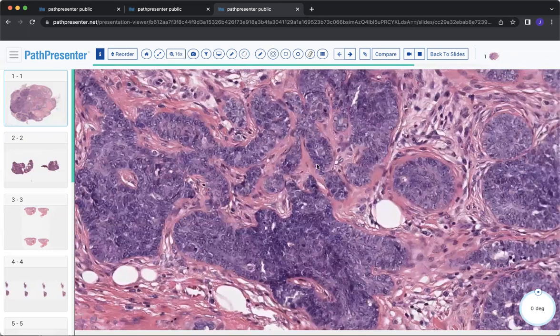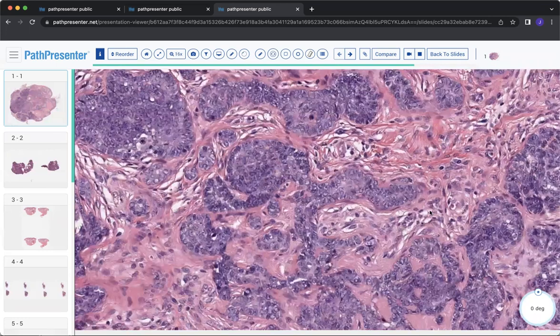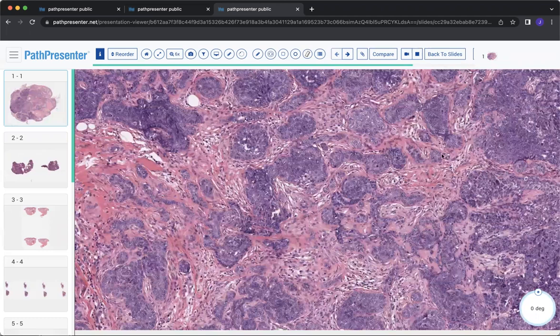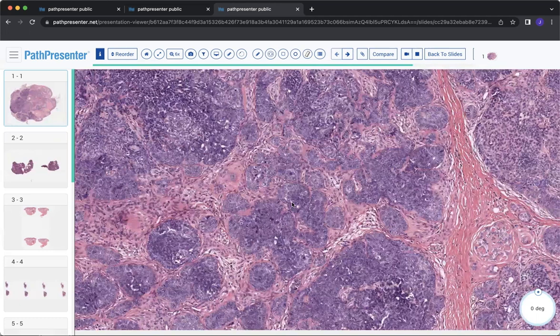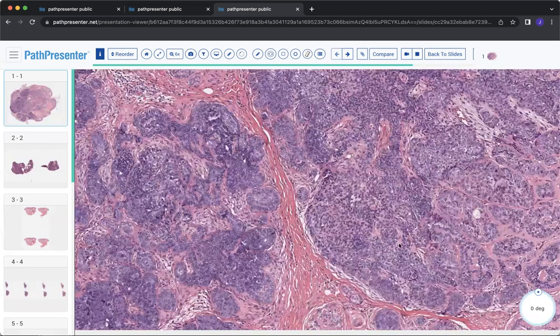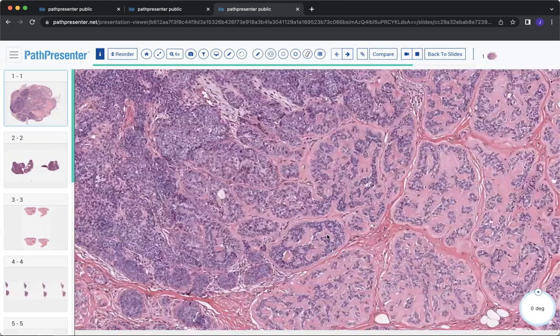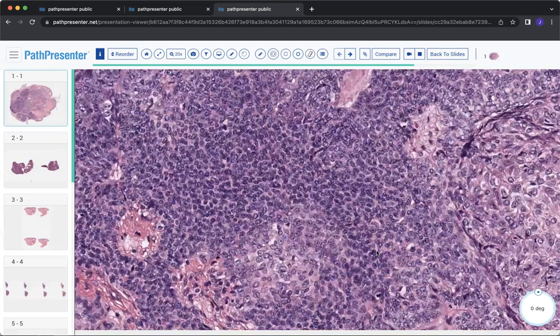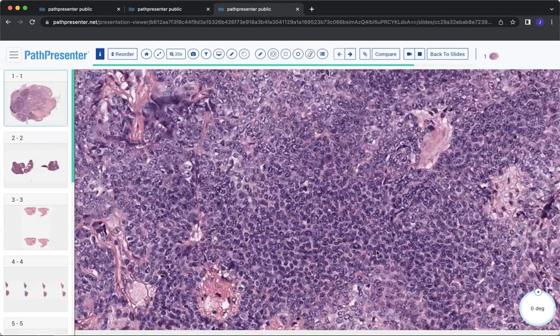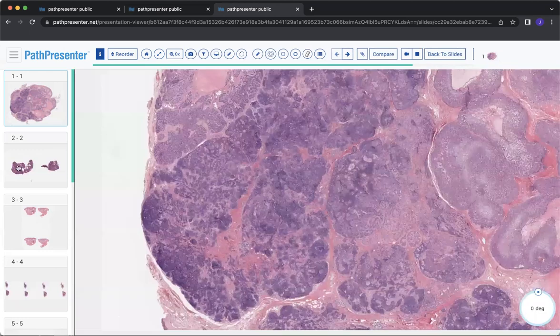Of course, a trichoepithelioma would also be in your differential diagnosis. Here, I don't really see a lot of keratin cyst-like formation, which would make me think more of a trichoepithelioma. Typically, trichoepitheliomas don't get this large. And the other thing is I don't really see amazing, what I call papillary mesenchymal bodies within this. But if you saw everything that I just mentioned, then you should definitely think about a trichoepithelioma. All right, so that is a trichoblastoma.